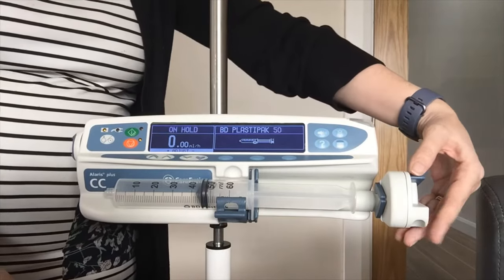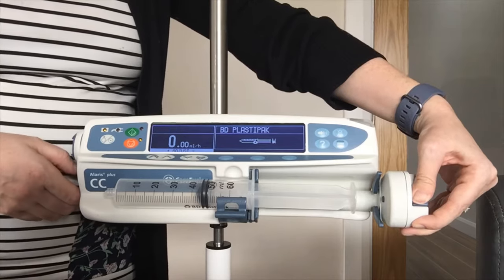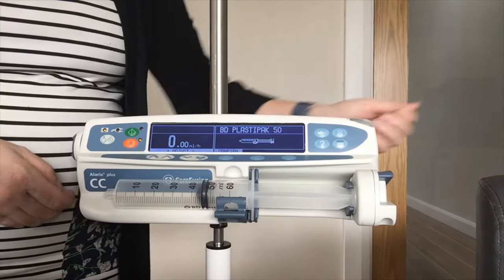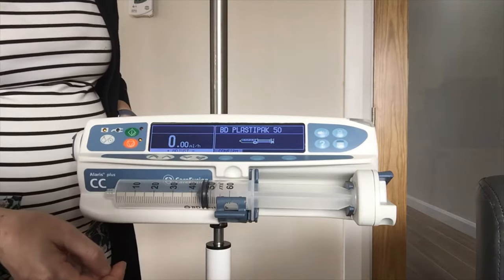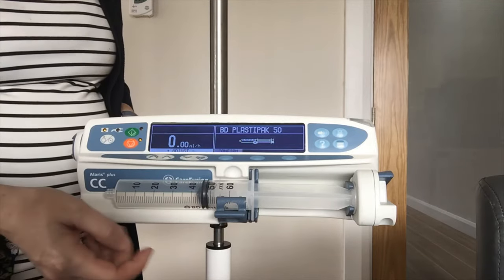When bringing the drive in, just make sure that your lever is down fully because you want to go over the plunger — you don't want to push the plunger. I can see now my confirm is flashing on screen, so it is happy that my syringe is loaded correctly, so I will confirm that and move on to the next step.